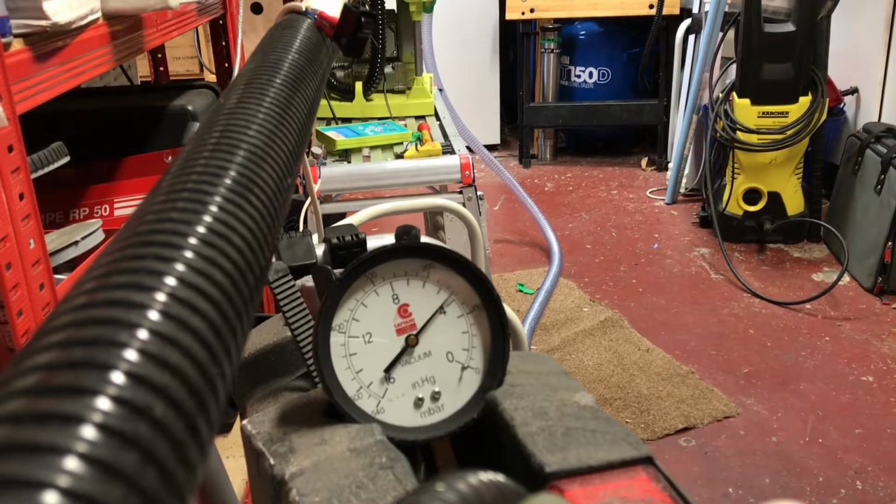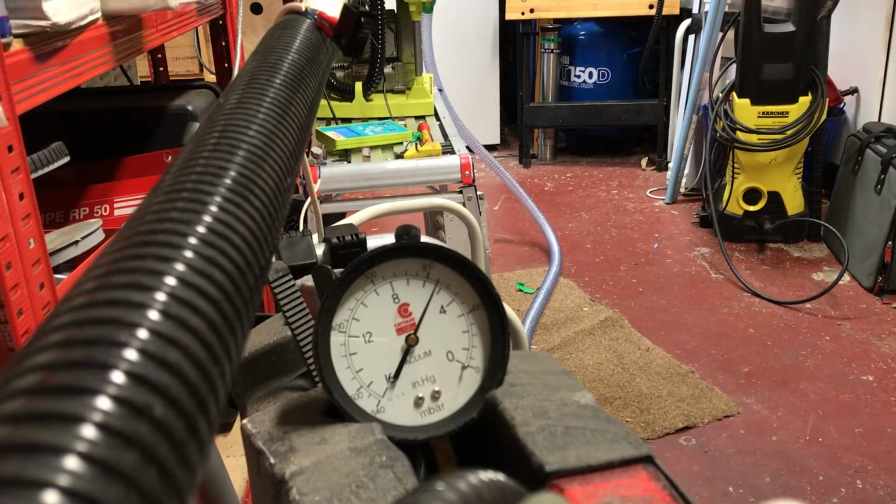So, removing the suction tip and putting it back in the hanger, you can see the maximum pull it's got, about 180, 190, which is good. That's the bypass valve opening up, the vent valve as we call it.